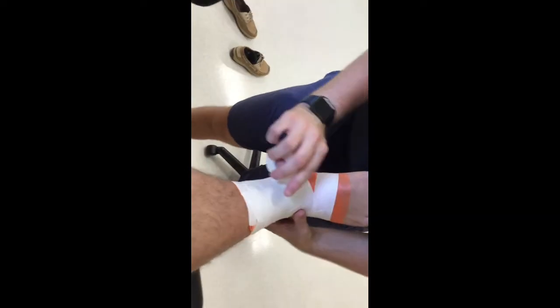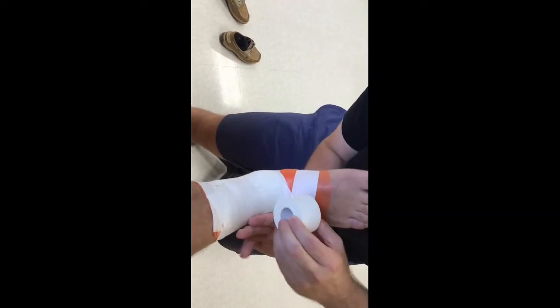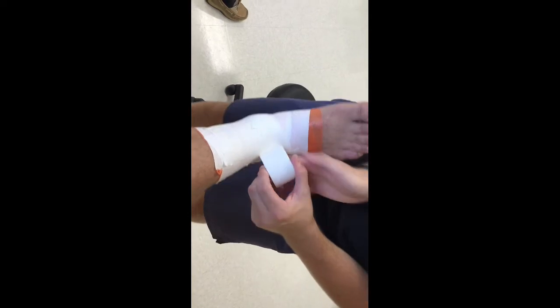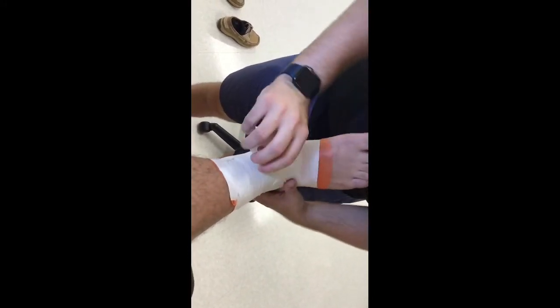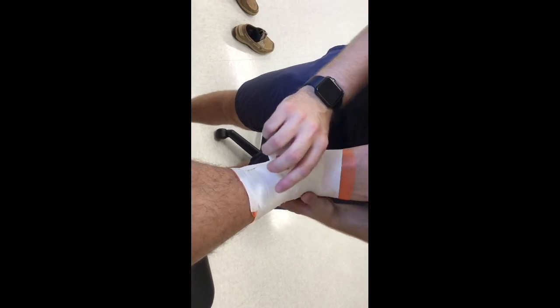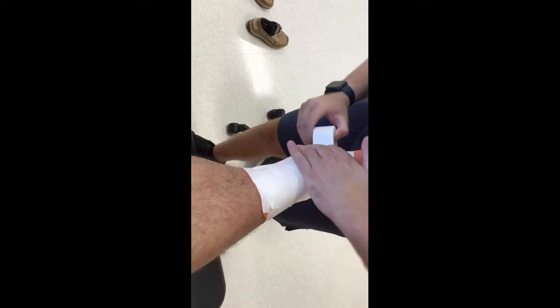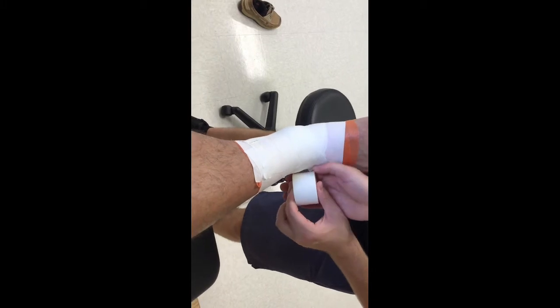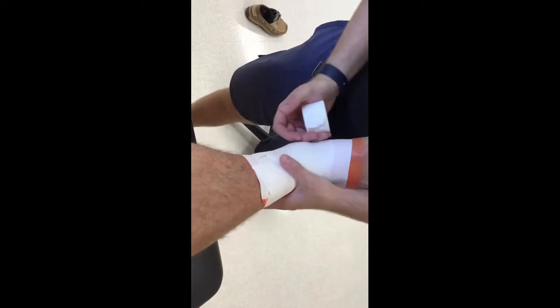So right down and up. And get one more in there. A little bit higher on this one so we can come down. And lock him in. And now we'll just clean it up.